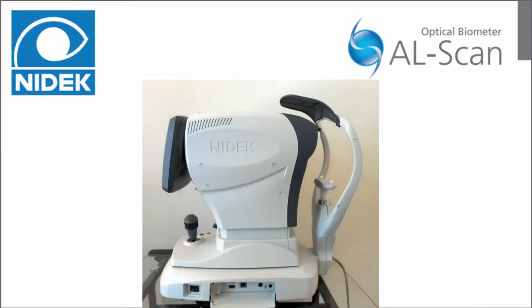The USB port is used for backup of the device, database, and device parameters using a flash drive. The LAN port is used to connect an external computer with a LAN connection. Depending on the configuration of your AL Scan, you may have more ports available to attach the optional ultrasound probe stand with A-scan and pachymetry probe attachments.